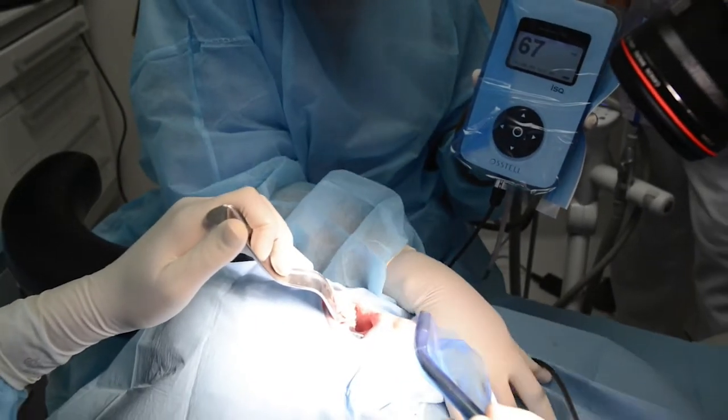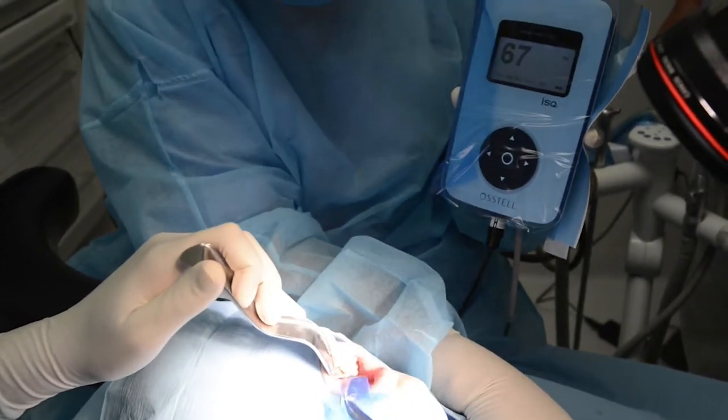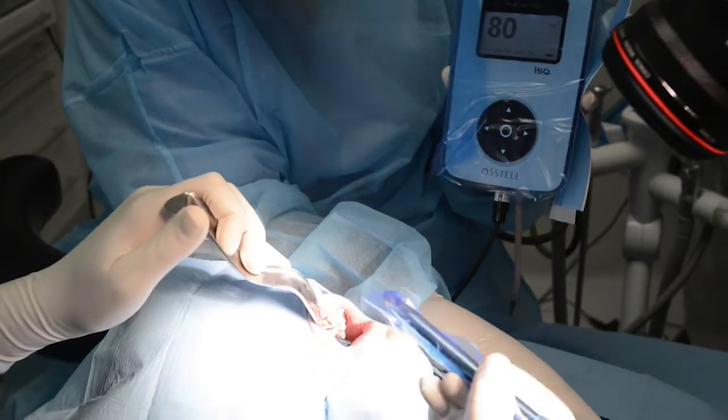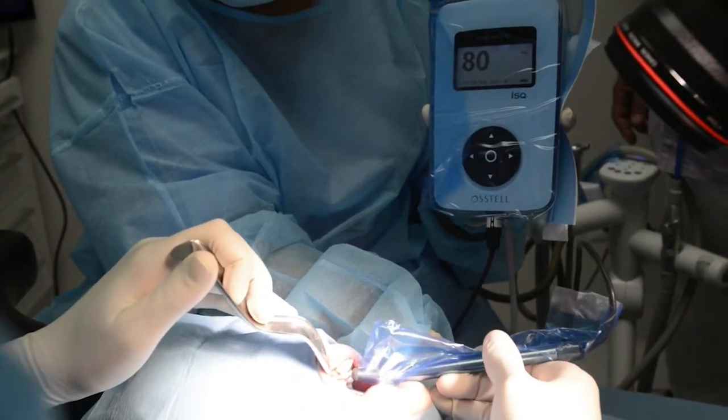The implant is going to be inserted, and here it's very important to look at the ISQ values, of course. So that's the previous measurement that was done on the previous patient. Now we're going to measure here the mesiodistal ISQ value, which is 80, as you see here, and then I'm going to measure also the buccolingual, that's still 80.